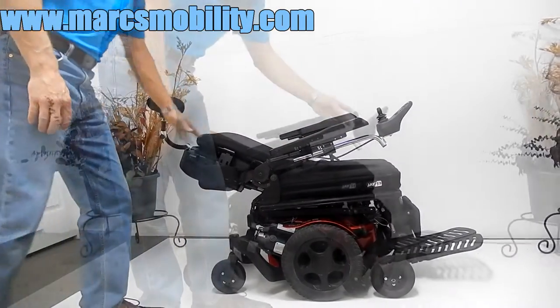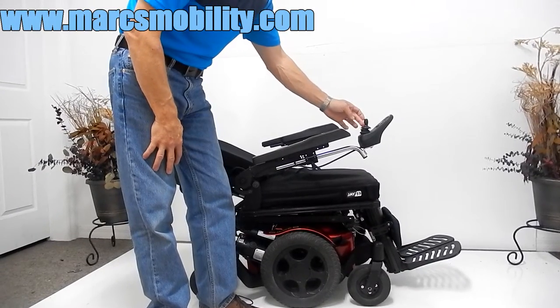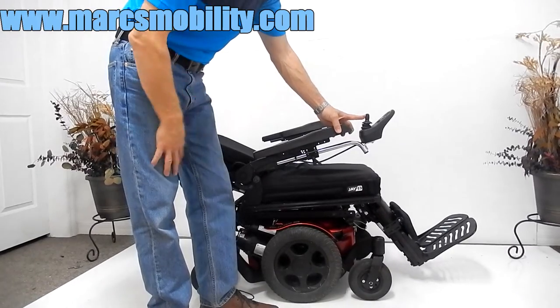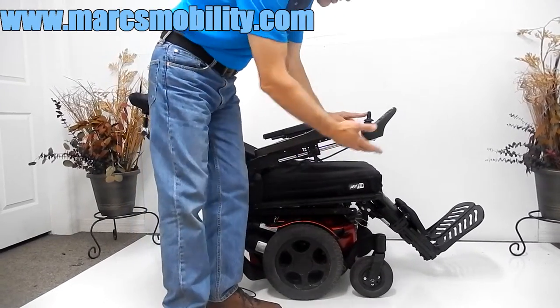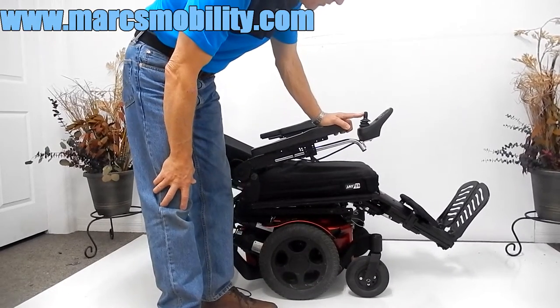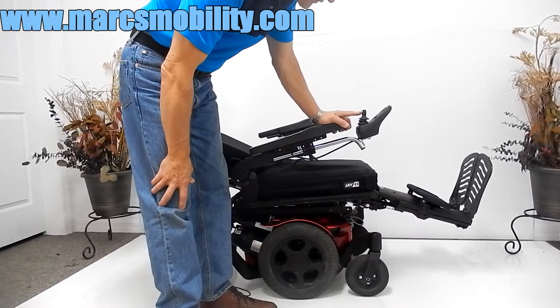This is not a full recline, but now I'm going to show you the electric legs. You can get the legs and the back to go back at the same time — I've done them individually here. These legs are adjustable; if we need to adjust them depending on the length of your legs, we can do that.